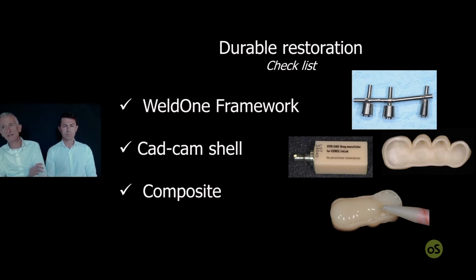These three materials combined together create a very strong synergy, and this synergy is creating this unique artifact that is the durable bridge.